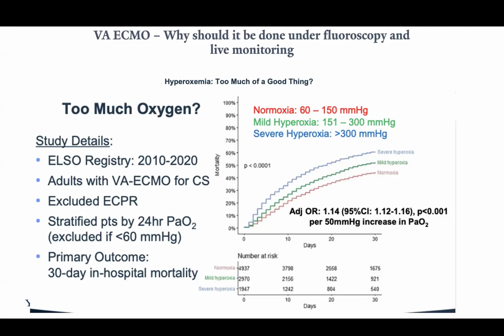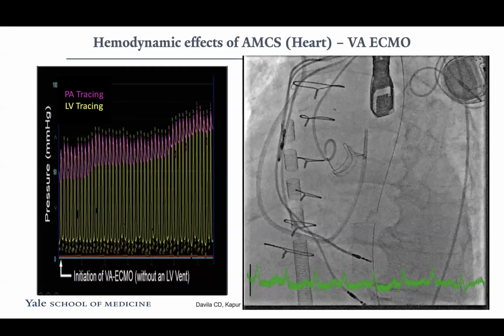So you need two things. You need possibly a distal perfusion catheter, and you need a right radial sheath before the patient leaves the room. And that's for two things. You need to check normoxia, and the quicker you resolve this, the better the outcomes, and you avoid brain injury and other things that happen with immediate hyperoxia. And then you have to check for north-south syndrome or the Harlequin syndrome, which we'll touch a little bit on.